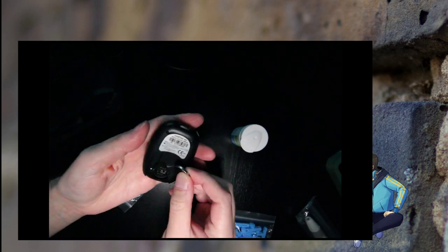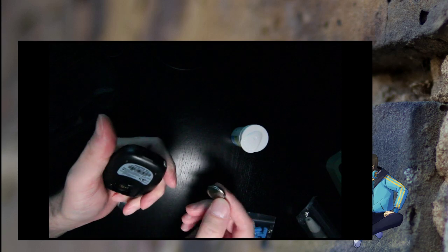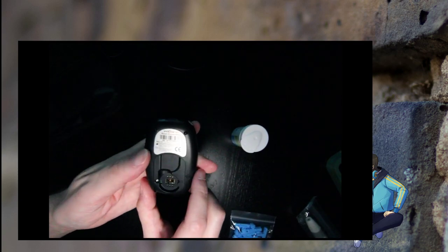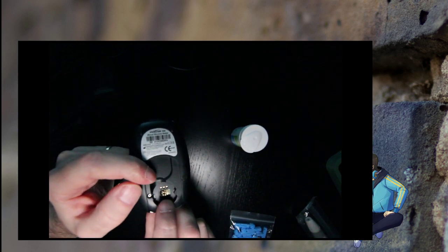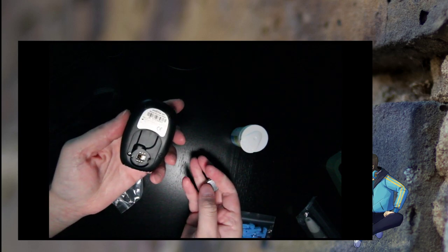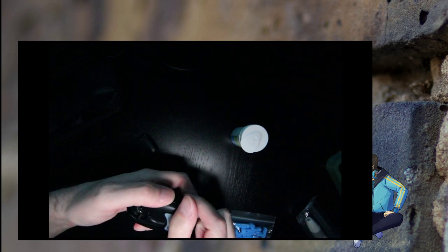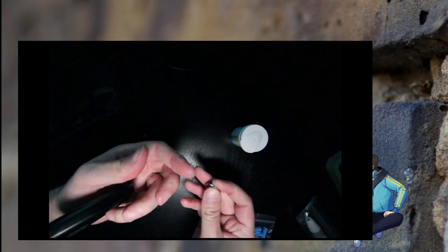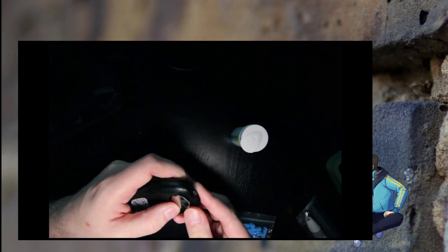And it's interesting because this gives me a feeling this was meant to take two batteries, but they may have made a new version. Also, funny thing, this seems to have some pins on the bottom, which is probably for control from the factory manufacturing and stuff, which is interesting. The screws, it seems to be held with a single screw, and it is a Torx screw, which is a bit sort of surprising, but we'll see.